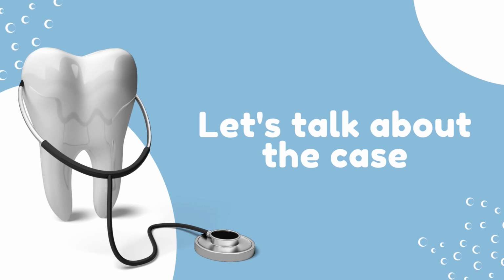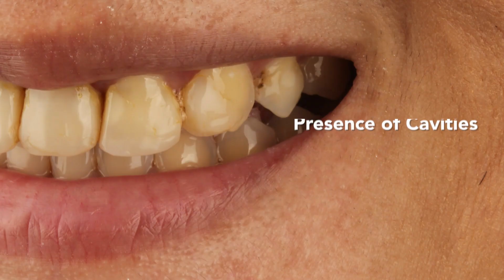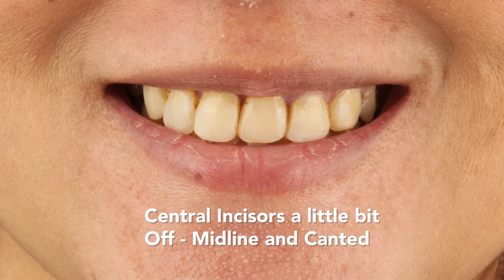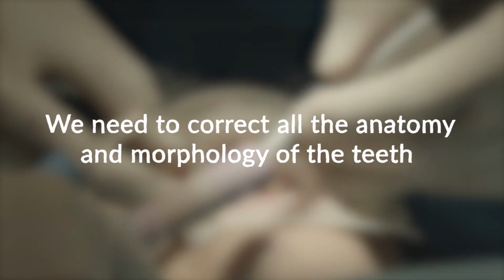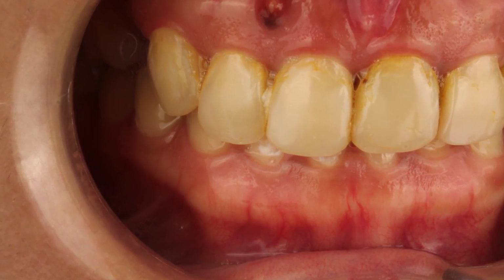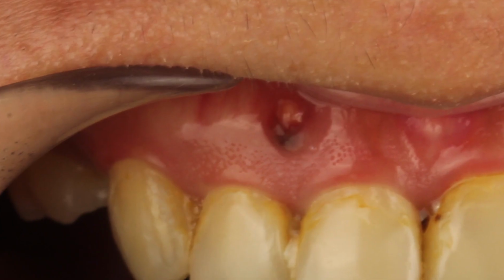So let's talk about the patient's case here. So as you can see, multiple composite restoration, direct composite veneers, presence of cavities, and uneven distribution of the width and the sizes. No? Medyo, the two front teeth, medyo a little bit off midline and canted. And we really have to correct all these morphology and anatomy of the teeth kasi hindi siya talaga maayos or not distributed equally. So we have to make sure that we deal with the infection as well.